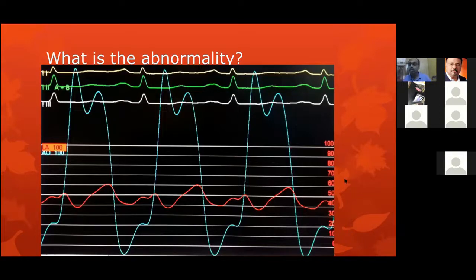Clinically, how to differentiate giant and cannon A wave? Cannon A wave is seen synchronous with ventricular systole, so it is synchronous with the carotid. Whereas the giant A wave is pre-systolic.